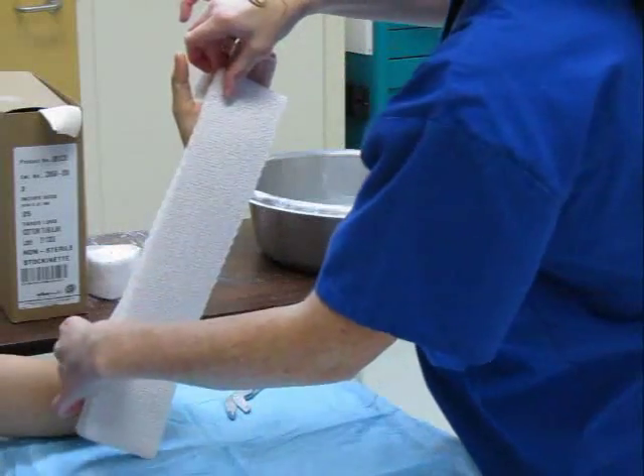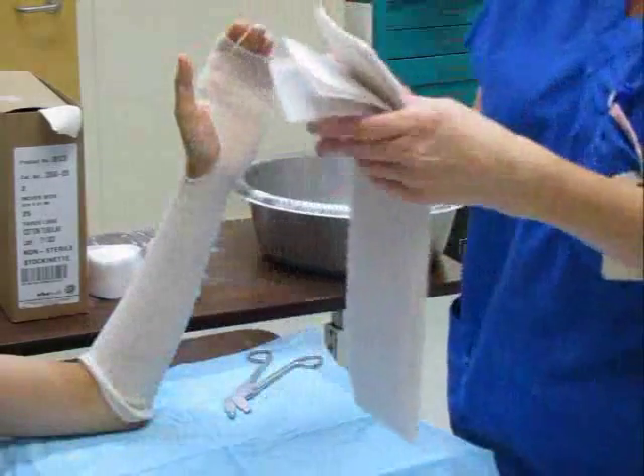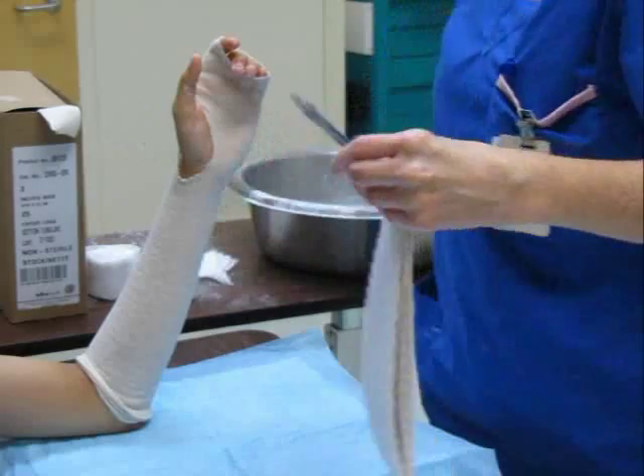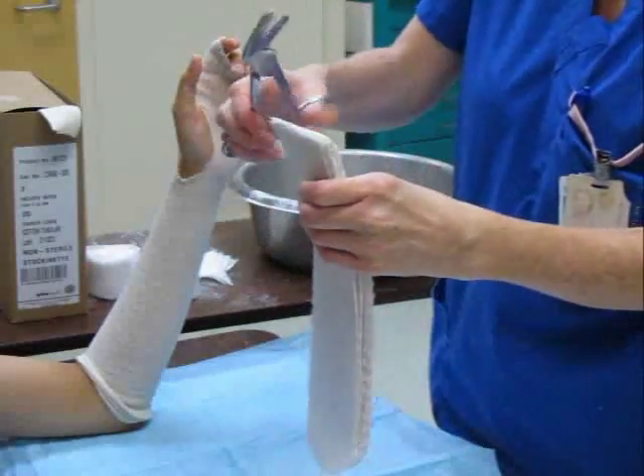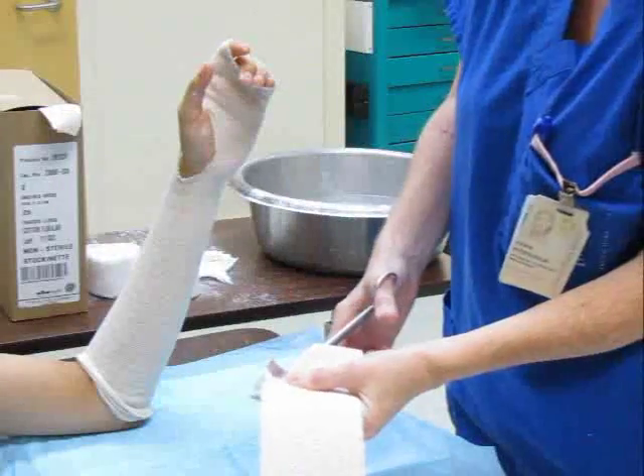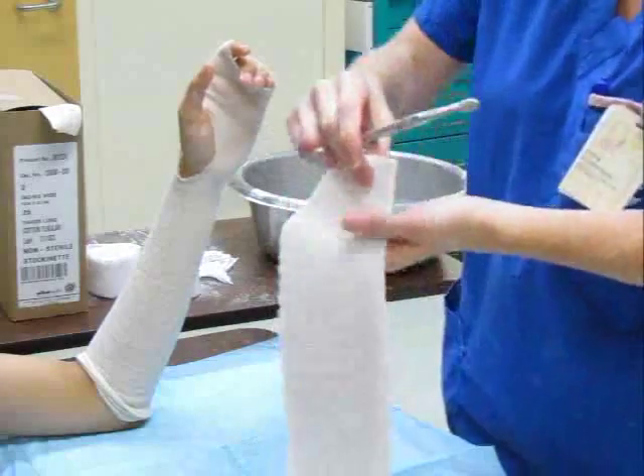The length of each plaster slab should equal approximately 1-inch less than the distance from the elbow crease to the palmar crease. Trim slabs as needed. Cut a figure-of-7 notch in one slab approximately 1-inch from the end of the plaster. Trim one corner off the second plaster slab.